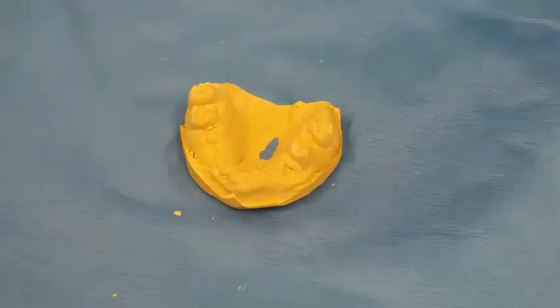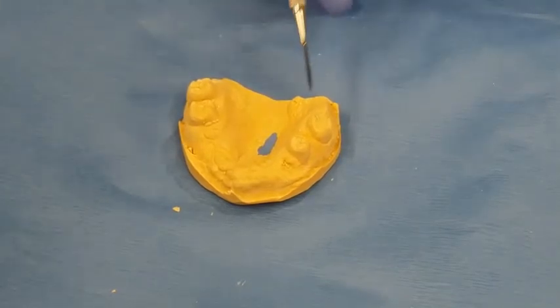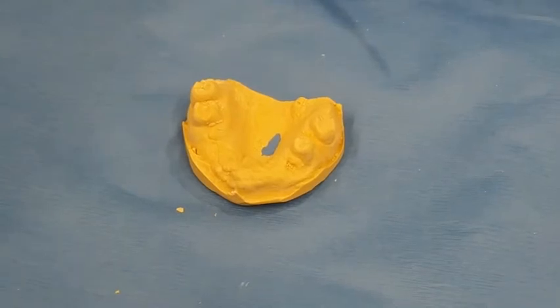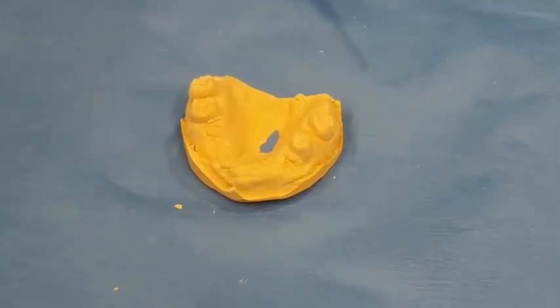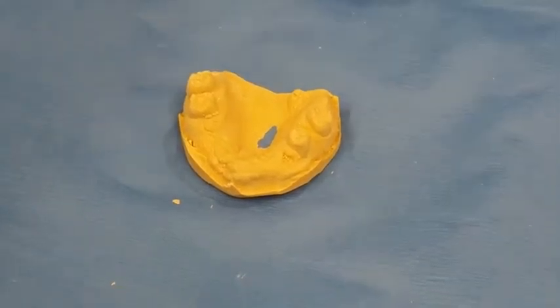And if I dare to take a final impression with an elastomeric material, maybe I will be performing some extractions by impression, which we don't want to do because we don't have the patient anesthetized, and that's not the way we do extractions. So what are the options we have?